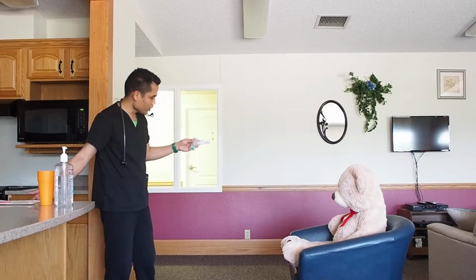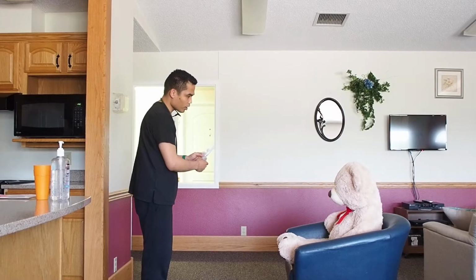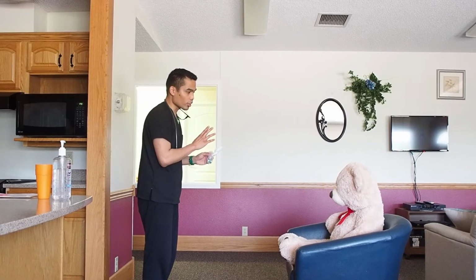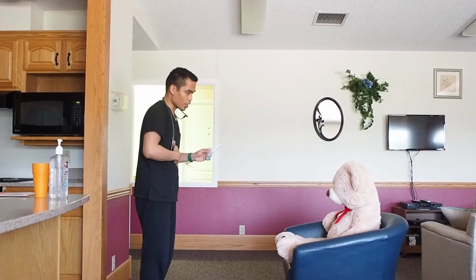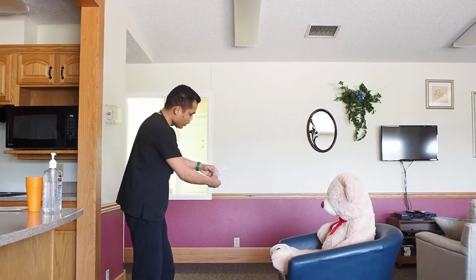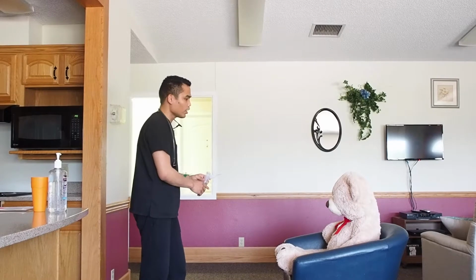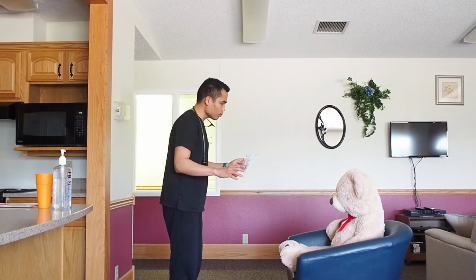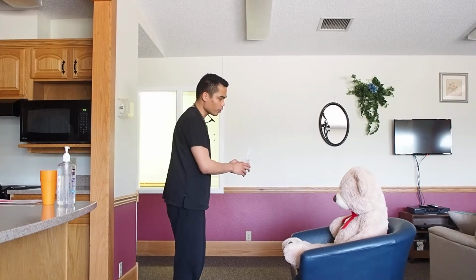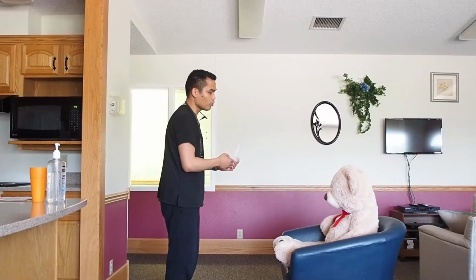So this one is the inhaler. This one is portable, and before we proceed, the preparation is you have to exhale all your air out away from the device until you feel your lungs are empty, like this. After that, check the device and twist it until you hear a click sound, which means it's ready to use. And by the way, when you exhale all your air out, please don't exhale in front of the device. Because it is a dry powder form of medication, if you exhale in front of the device, it might lead to clumping.